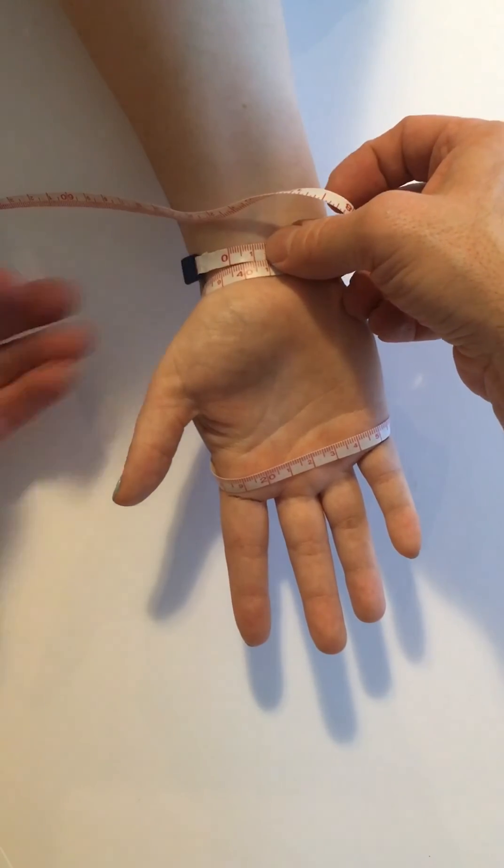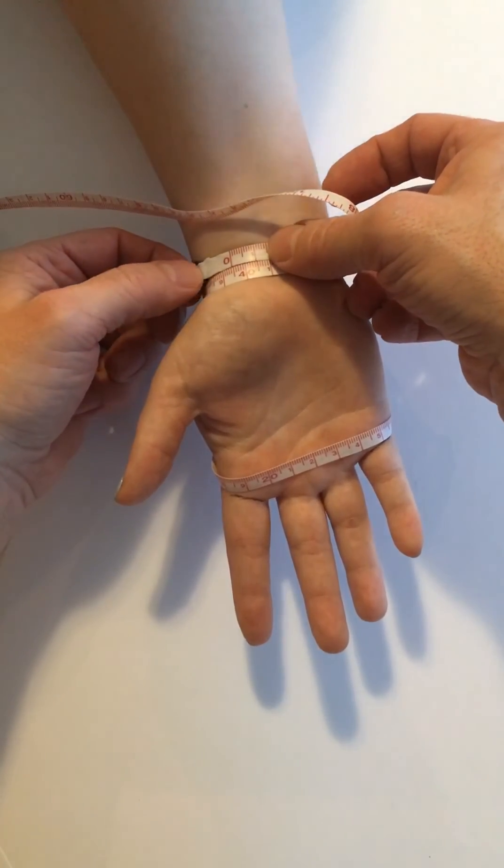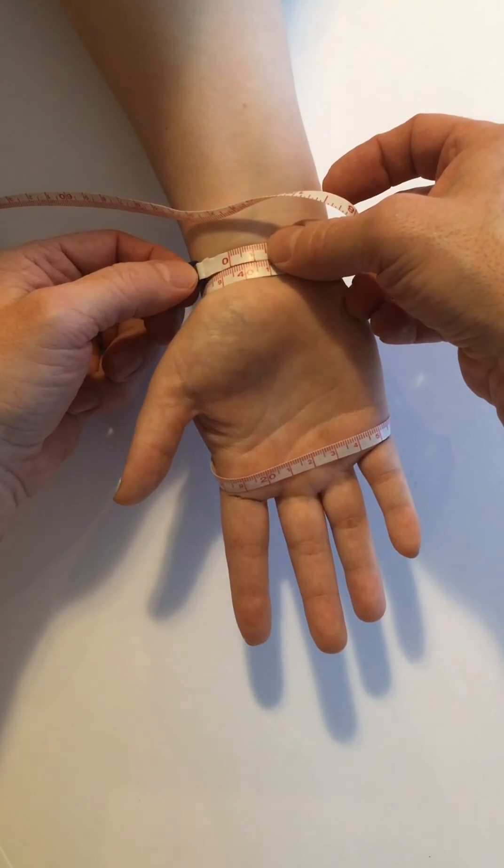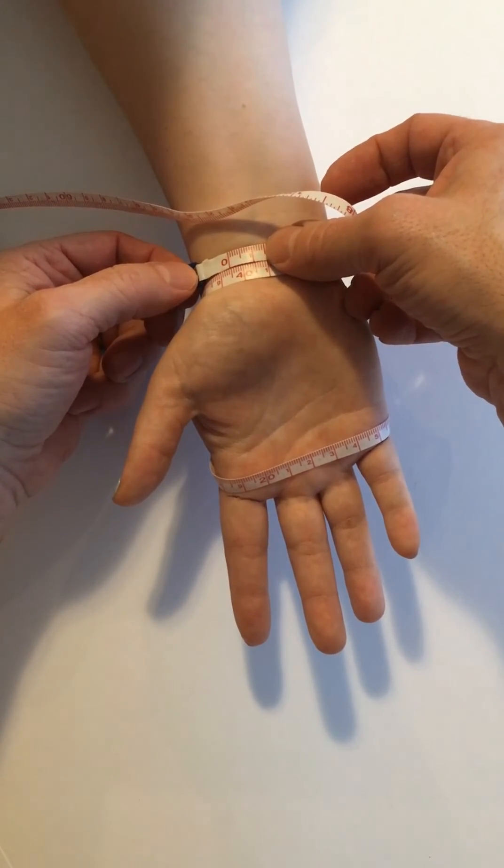But now you can see that once we snug it up a little bit our measurement is about thirty-nine point five centimeters.